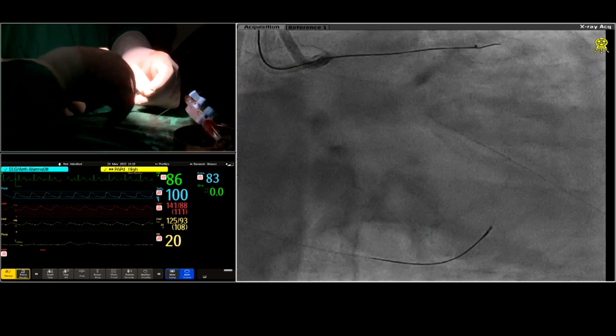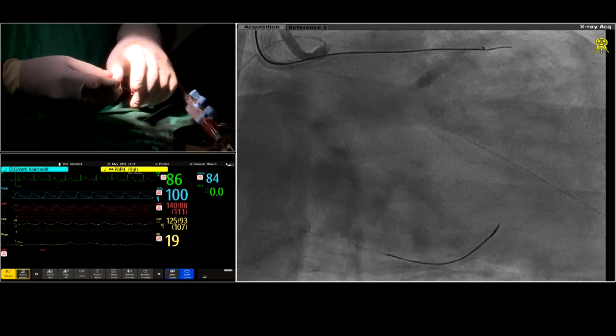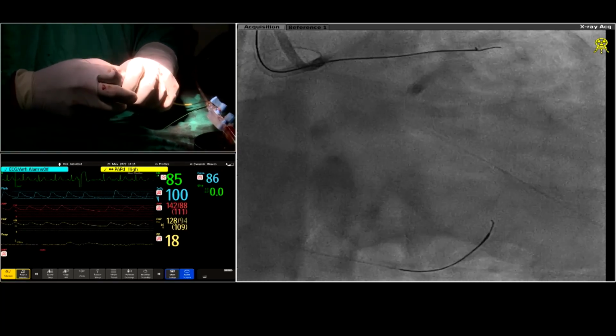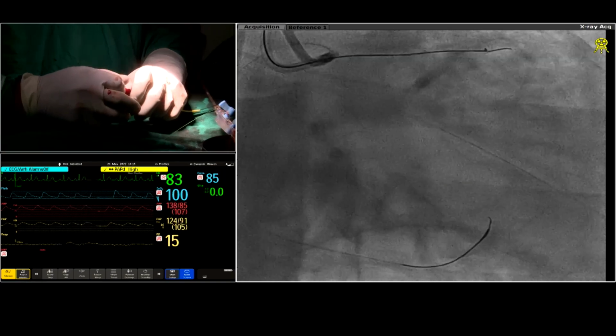Dr. Goel, do you use CT angiography for these CTO procedures prior to this? How frequently? Not much, I would say. Not much, but yes, if there are long occlusions and you don't know the anatomy, then you can use it.